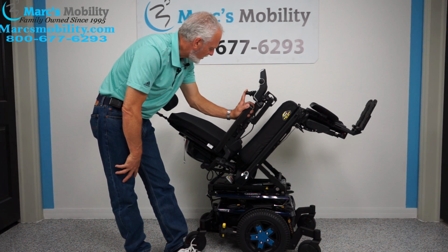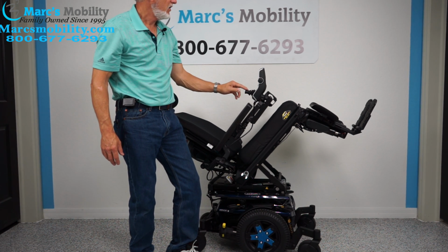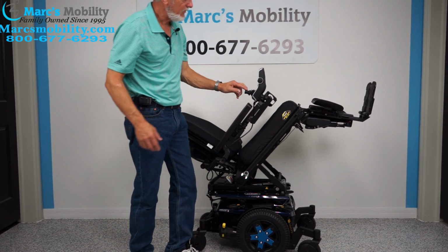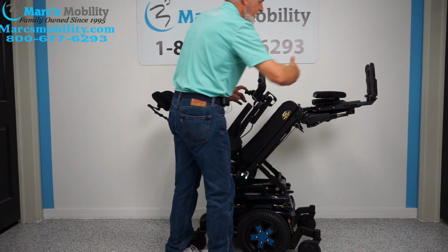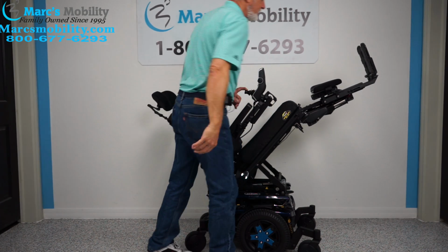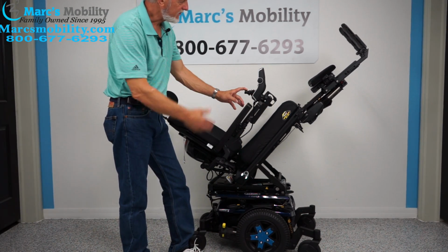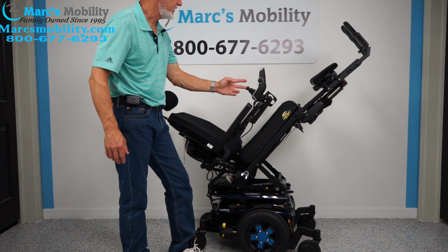So if you wanted circulation, another thing you could do, I'm going to move it to the feet. You can extend those feet all the way up. Now, it doesn't really matter if you're 5 foot tall or 6'3". We can adjust these seats. This is all adjustable. We can move these foot plates in and out according to your height. Now this would be a little extreme if you had to do circulation. I just want to show you the extreme position.